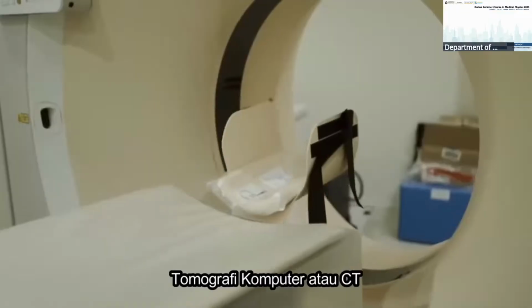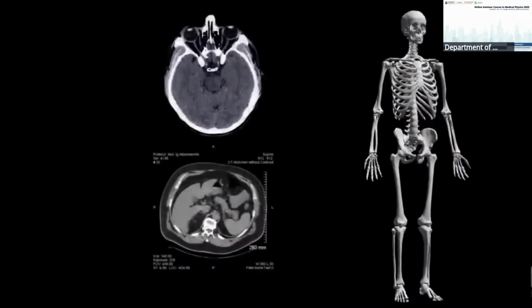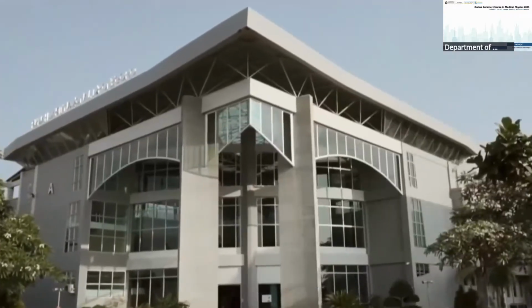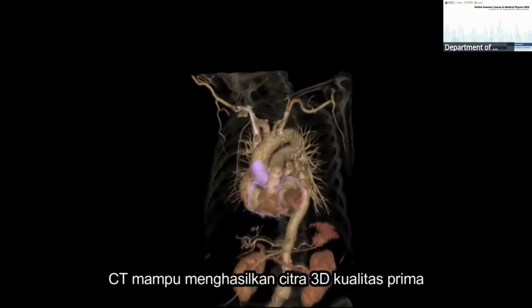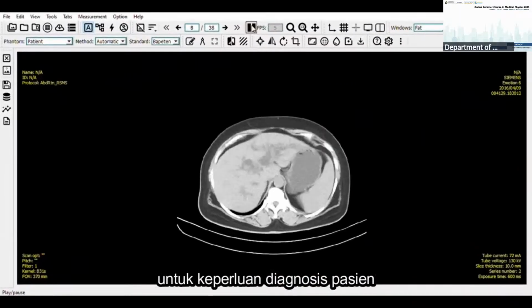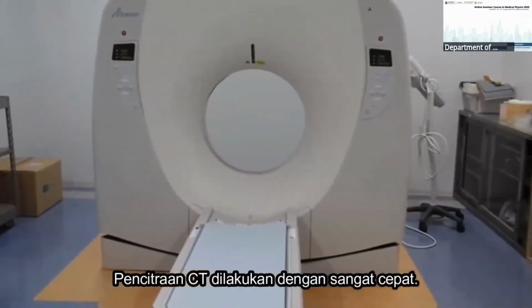Computed tomography or CT is an excellent tool for modern medical imaging. It's available in almost all hospitals throughout the world. CT produces 3D images with an excellent image quality for patient diagnosis purposes. CT imaging is carried out very fast.